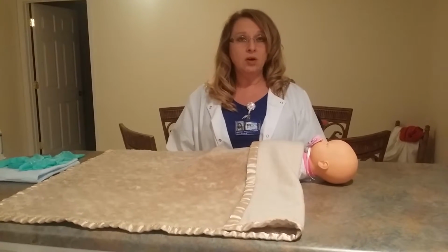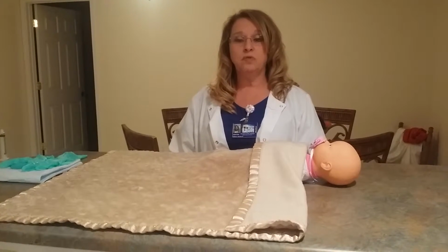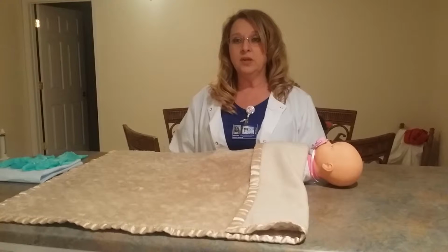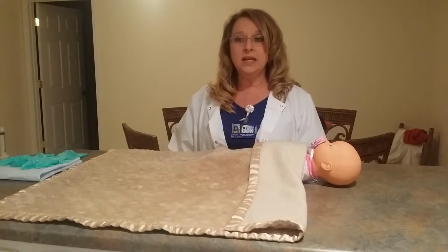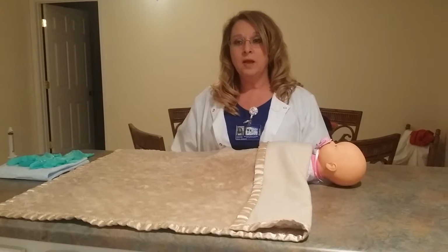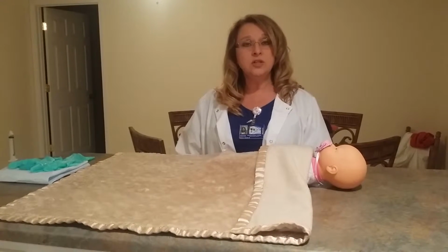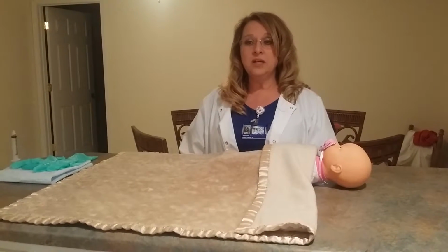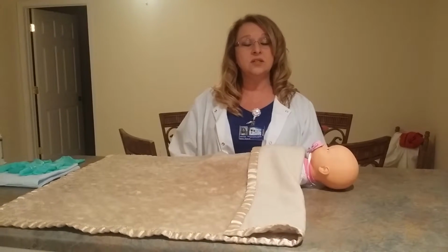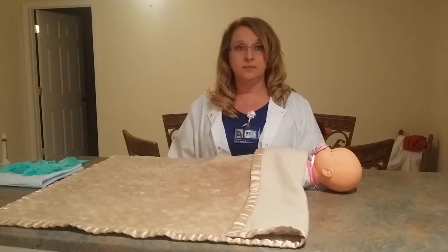Be sure to follow CAUTI prevention practices such as performing hand hygiene prior and after Foley manipulation, maintaining a sterile, continuously closed drainage system, maintaining unobstructed urine flow, and emptying of the collection bag and discontinuation of the catheter as soon as it is no longer clinically indicated.